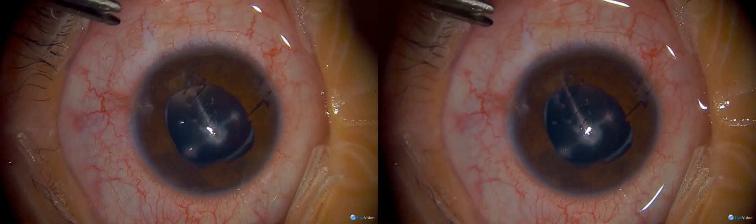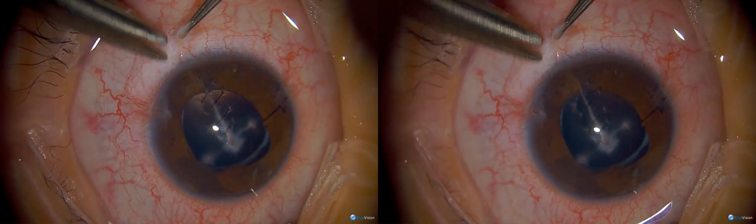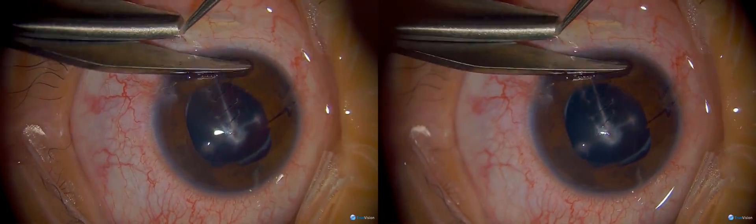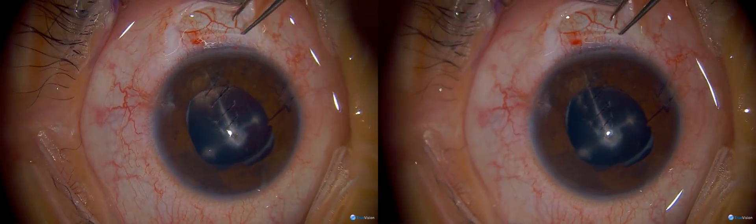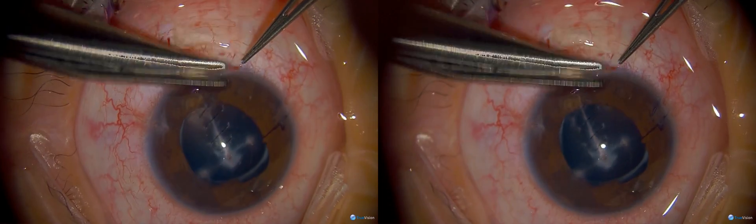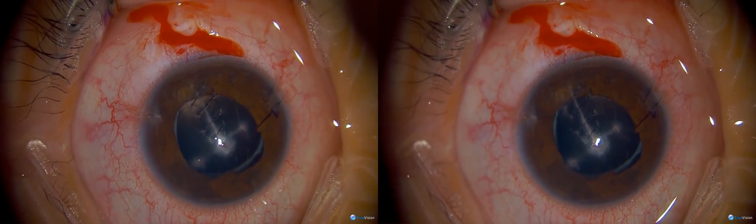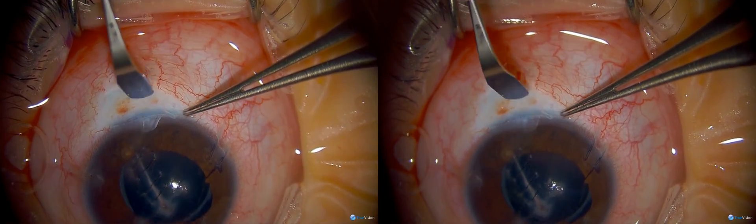In children, the limbus is a little further back. The Tenon's ends about one to two millimeters, so you hold further back. You cut down to scleral tunnel across, and for the peritomy you have to pull up — that's the only way to get conjunctiva off the limbus. You can use a regular knife for this.